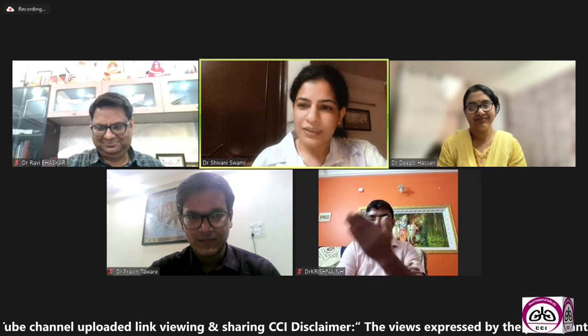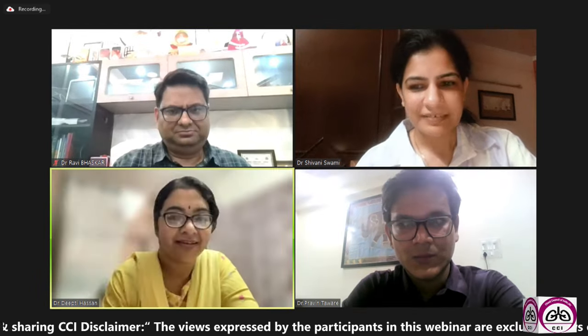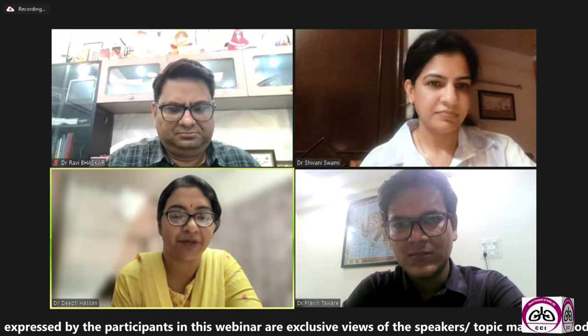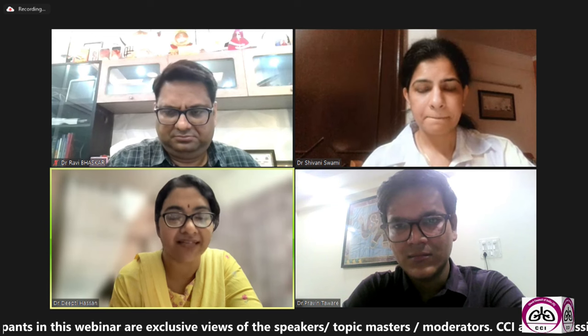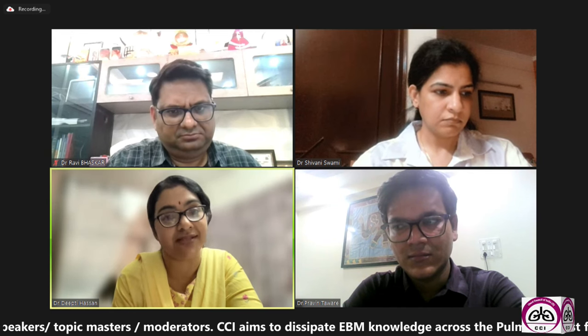So thank you, sir. With that, one last quick question to Dr. Deepti about smart inhalers. I think the discussion is going to be incomplete if we don't talk about it. While I was reading about this topic, I got to know about smart inhalers, not yet in India, but something to really look forward to. The device is the ProAir Digihaler, and it has a sensor which detects not only the number of doses the patient has taken, just like a dose counter, but also the time and date of use, as well as the location where the patient has taken that drug.